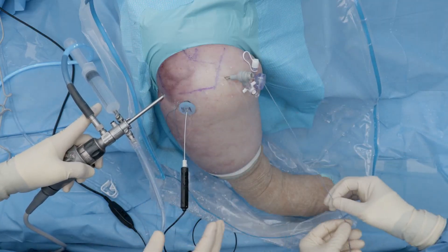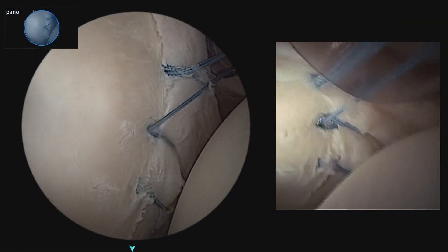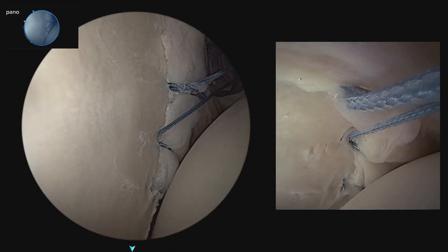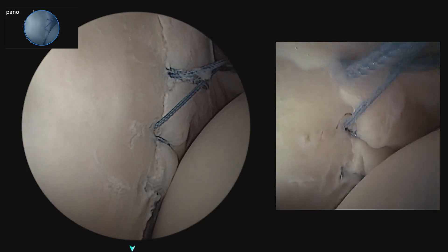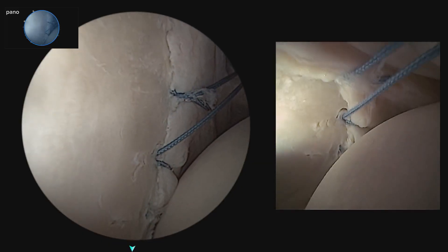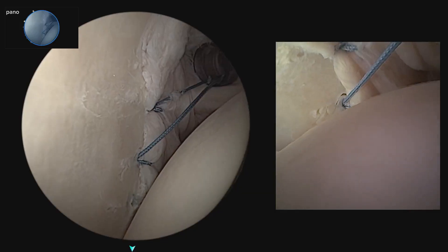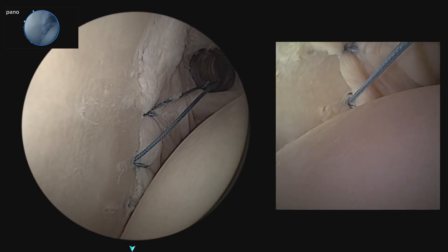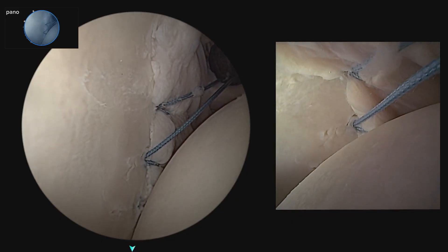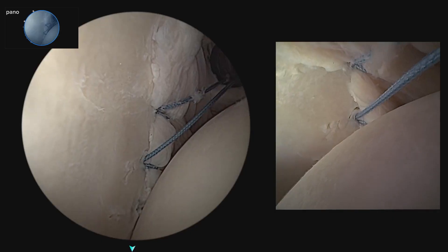Now let's finish our Bankart tensioning. We've already tensioned the most inferior anchor and now progress superiorly with our middle anchor — look how nicely that brings up a bumper. Finally we tension the most superior anchor, and we can watch it from both the anterior superior lateral portal with the nanoscope as well as posteriorly from the panoscope. Now we cut them flush at the surface.